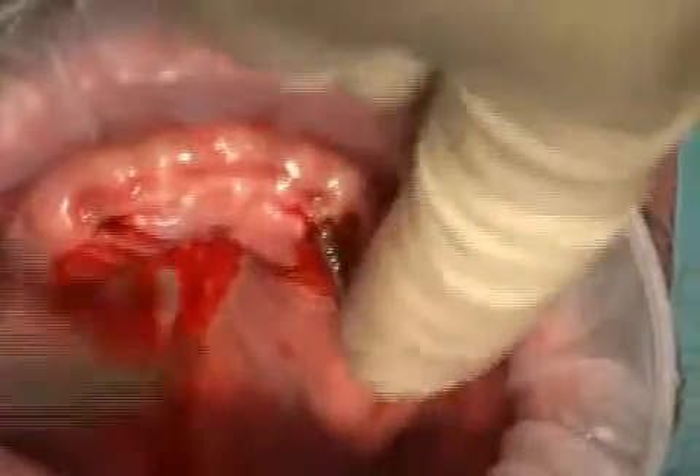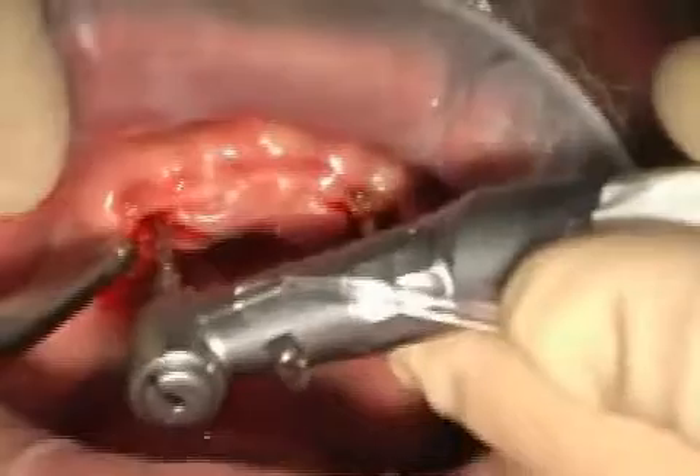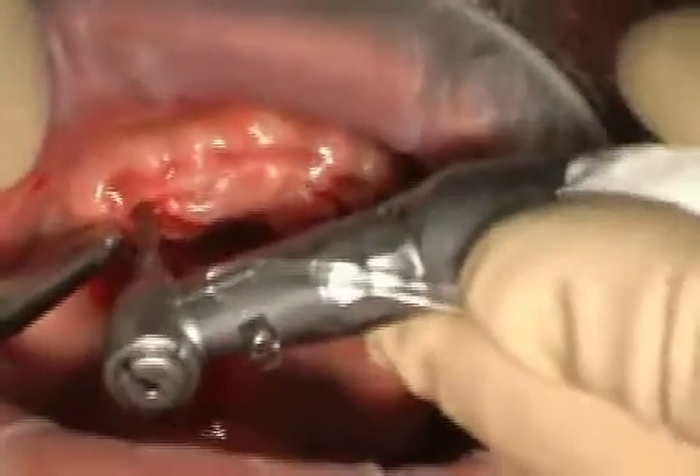The orientation pin provides orientation when the next pilot drill is placed. Through these simple means, the surgeon can place the implants parallel to each other, facilitating the subsequent provision of the implants with teeth.